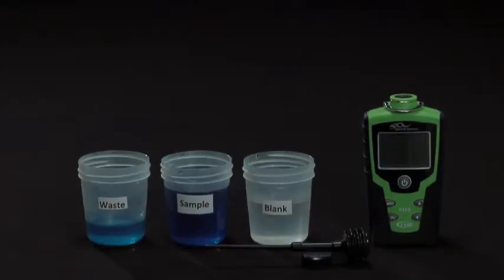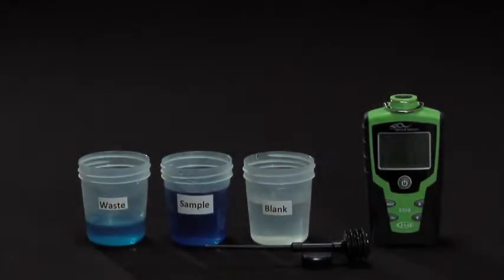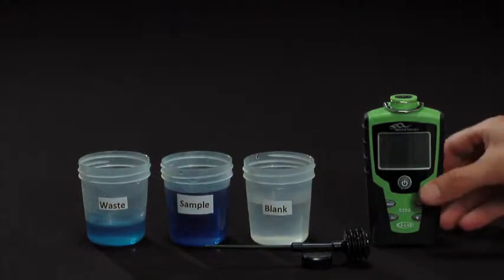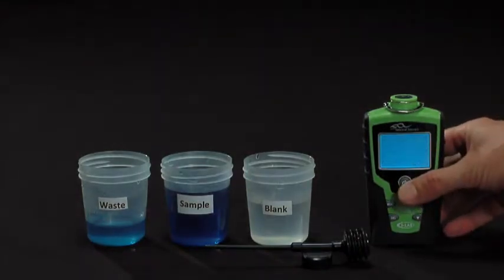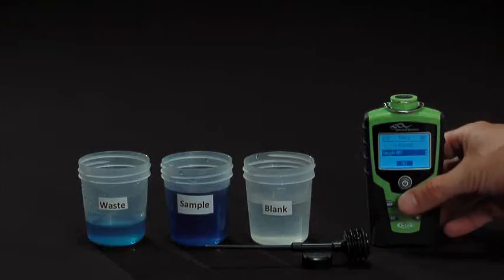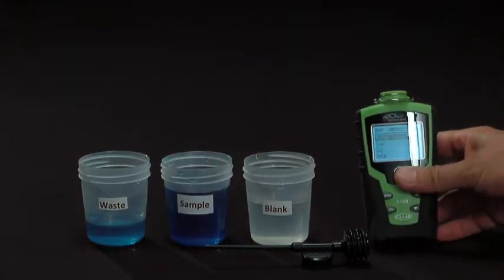This video will demonstrate the proper technique for obtaining a sample using the Samplet with the iLab. The first step will be to turn the iLab on using the center button, then press the menu button and scroll and select the methods folder.